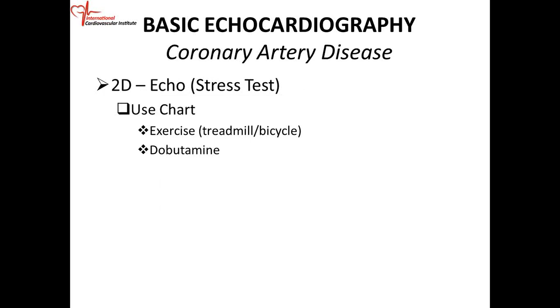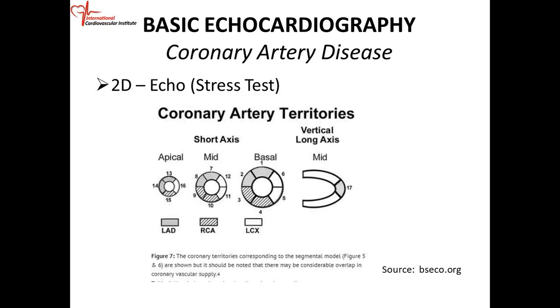When we do stress echo, we can do what we call exercise stress echo or dobutamine stress echo. When we talk about exercise stress echo, we can do the treadmill exercise stress echo or a bicycle exercise stress echo. You can also do dobutamine stress echo. Okay, so these are the common ones that you can do.